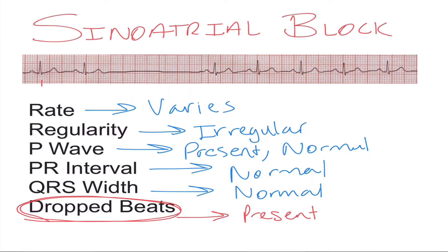Let's take a look at the strip. If we were to march this out and go from QRS spike to QRS spike, we'd get that amount of distance — it's just over three and a half boxes. If we carry that three and a half box distance and march it out to the next QRS, it should line up pretty close.